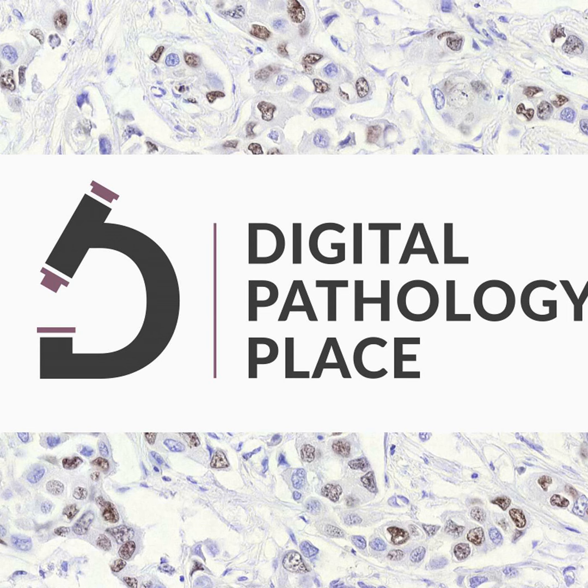In plain words, it's no longer enough to get a scanner and start digitizing. The image and data management system is a must, and it's often separate from your viewer and your image analysis software. High-throughput analysis is another major application of digital pathology in research. This involves the automated scanning and image analysis of large numbers of histopathological slides, enabling researchers to analyze many samples simultaneously. This can greatly increase the speed and efficiency of research studies, particularly in large-scale studies or when dealing with complex disease that require the analysis of multiple tissue samples and multiple markers.